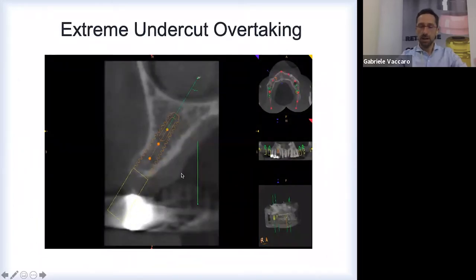Okay, now let's see why we face tilted implants. It's easy to put a tilted implant. A technician doesn't understand this, but they have to see that very often the bone is put in its place and we have to fix the implant inside the bone. So these are 30 degrees of inclination. It's not so much, but it can be a problem if we figure out how the teeth could be over that implant. So the screw hole is exactly in the middle of the crown, right here.